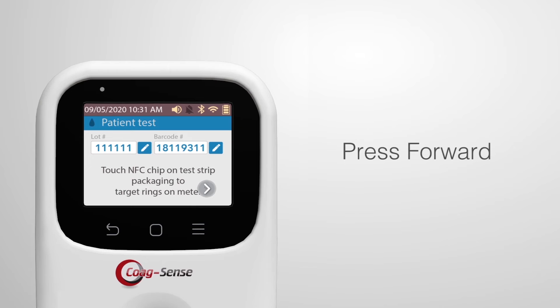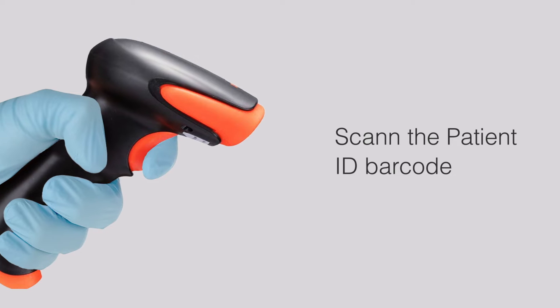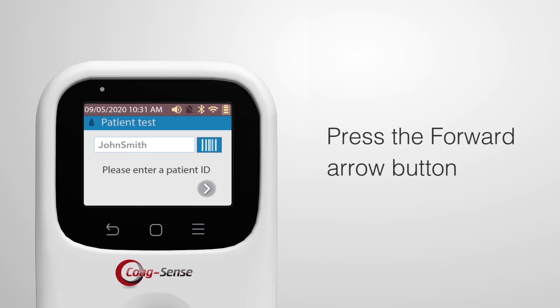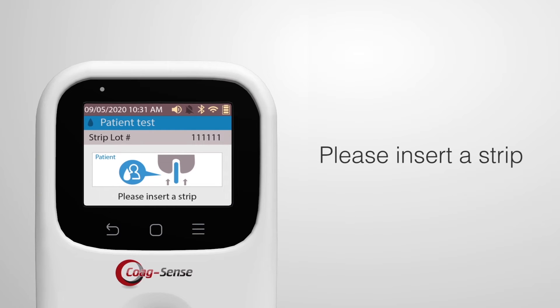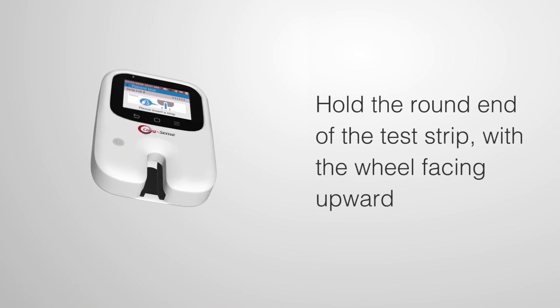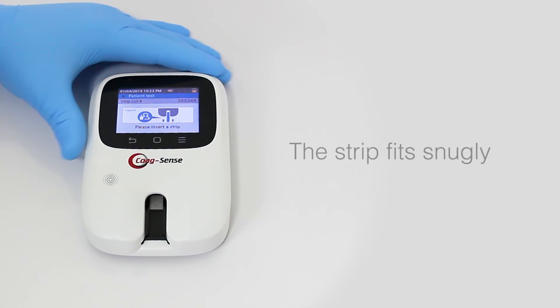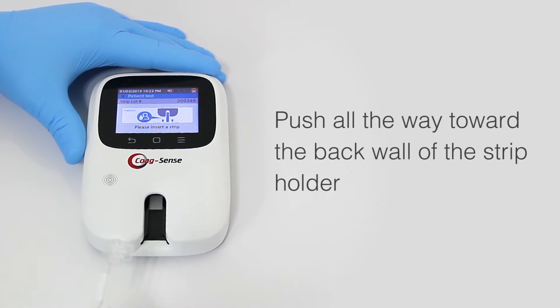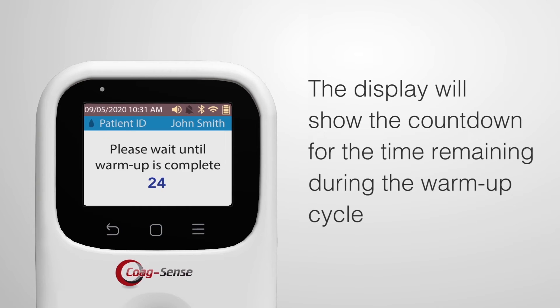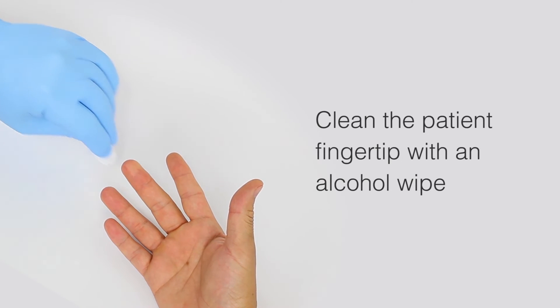Then press the forward button. If the patient ID feature is enabled, enter the patient ID or scan the patient ID barcode using an optional barcode scanner, then press the forward arrow button. The screen will now display the message to please insert a strip. Hold the round end of the test strip with the wheel facing upward and gently insert the strip completely into the meter. The strip fits snugly and should be pushed all the way toward the back wall of the strip holder. The display will show the countdown of time remaining during the warm-up cycle.